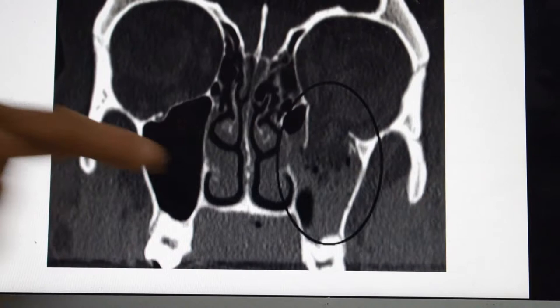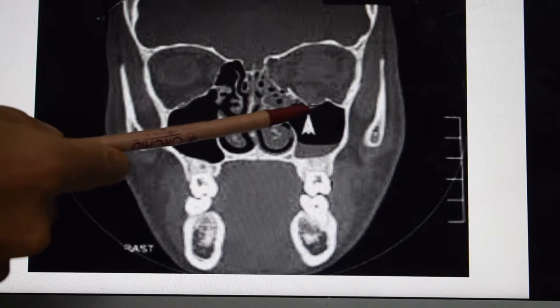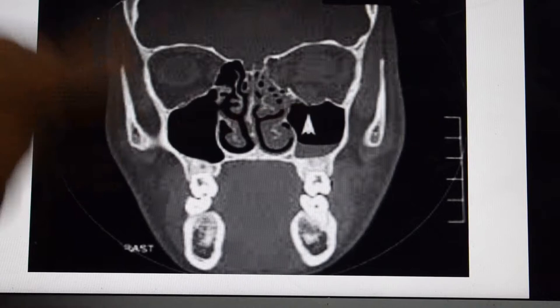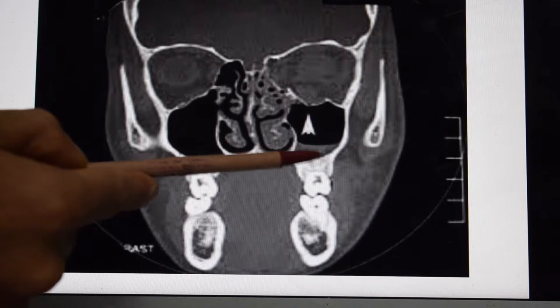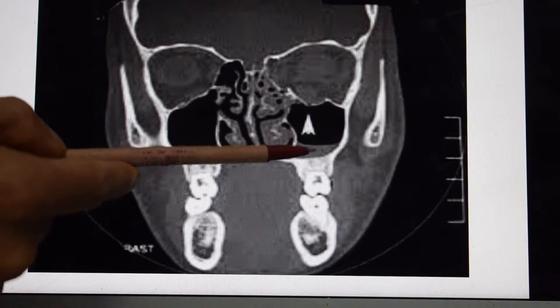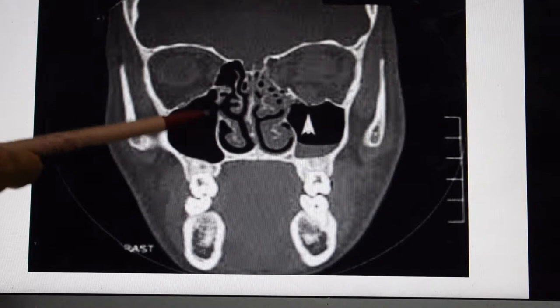This indicates a fracture of the orbital floor on the left side; the right side and the septum are otherwise intact. This fracture is not as large as seen in the previous scan, so it is not displaced. There is bleeding — blood has collected in the maxillary sinus. This is known as an air-fluid level in the maxillary sinus, or in medical terminology, a hemosinus — blood in the sinus. On the normal side the sinus is very clear, but here it has filled with blood because of this small fracture.